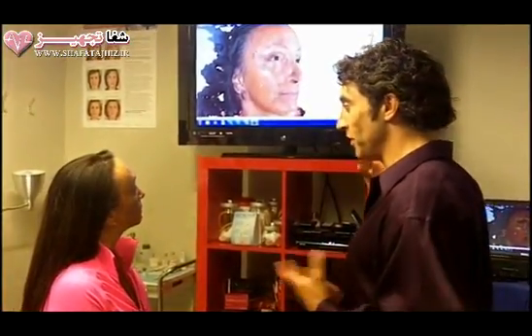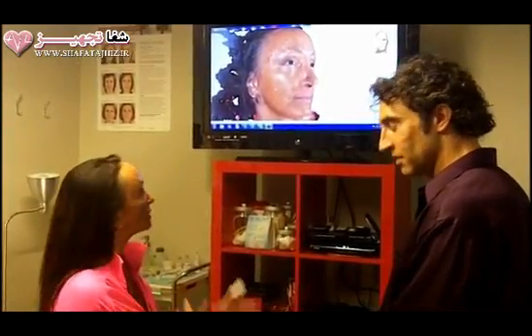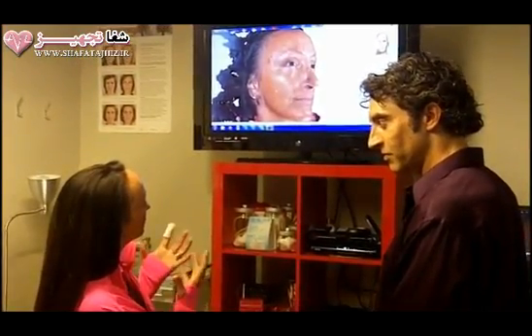The imaging, how do you feel about it? I think it's amazing. I see a different side of myself that I actually have never seen before, and your perception is not my perception, and it just gives me a whole area of, it's new. I mean, I haven't seen myself like this before.